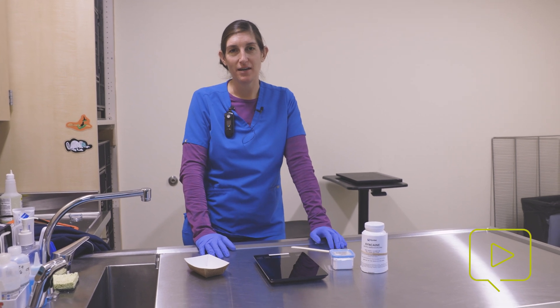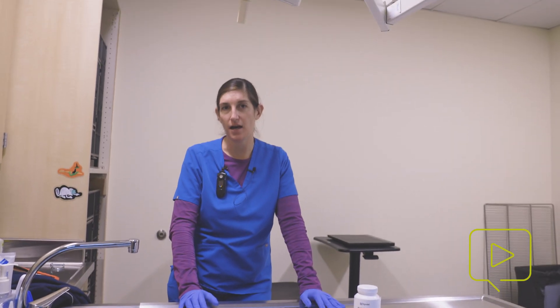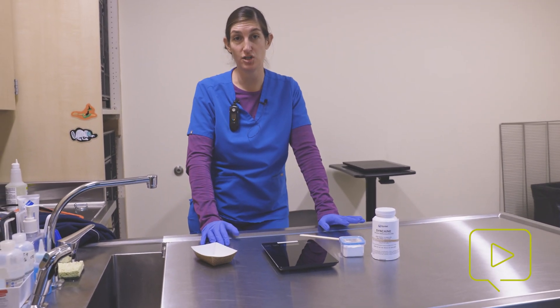Hi, I'm Dr. Flaminio. I'm an exotics veterinarian here at Dove Lewis. What we're doing today is creating a stock anesthetic solution for our Joanna Fish procedure.